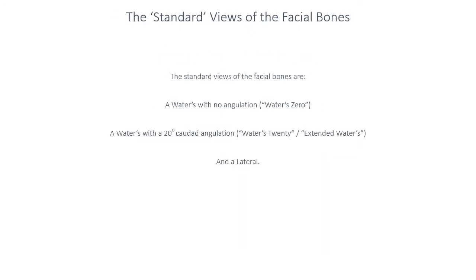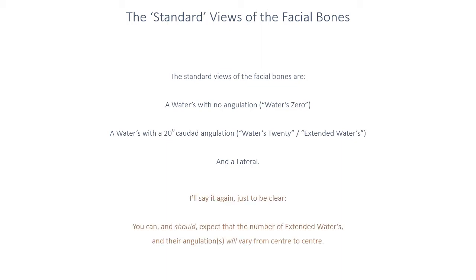In front of you there, you can see that I've listed the standard views of the facial bones, indicating a couple of Waters projections and a lateral. I would like for you to understand that this is an incredibly variable quantity, and that depending upon the needs or desires of the radiologist, maxillofacial surgeon, ENT surgeon and so forth, these things may change, and in fact are very, very likely to change. So please do recognize that this is quite a variable body region. It is going to change depending upon where you find yourself on placement or working in the professional environment.